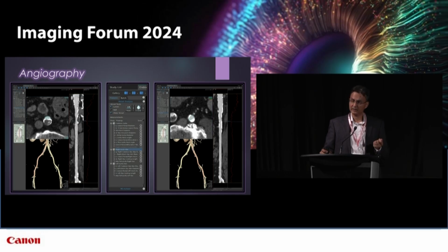And so why is lumen diameter important? As I was mentioning earlier, for TAVI patients, if you've got a prosthesis that you're going to be feeding up those vessels, you really need to know the minimal luminal diameter. So unlike the aorta where we're looking for dilation, this is actually looking for the smallest caliber size.